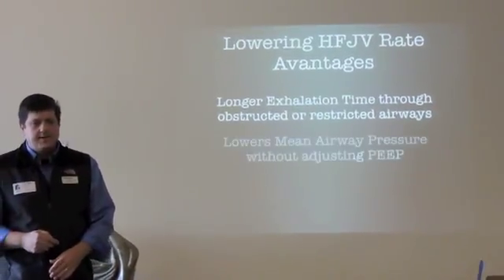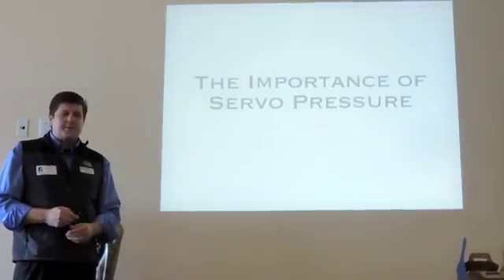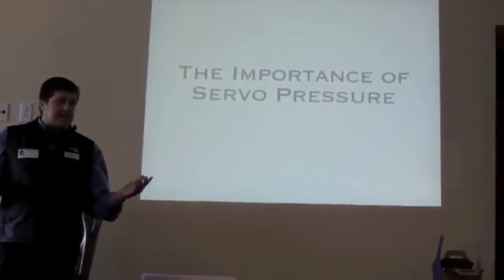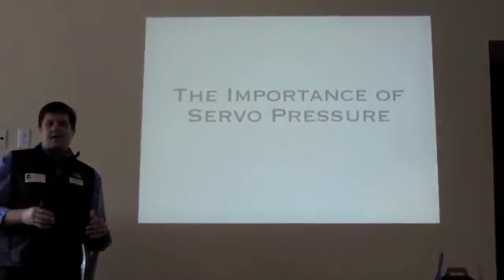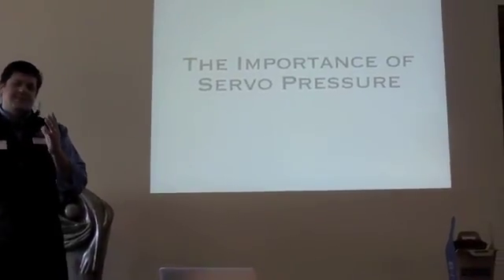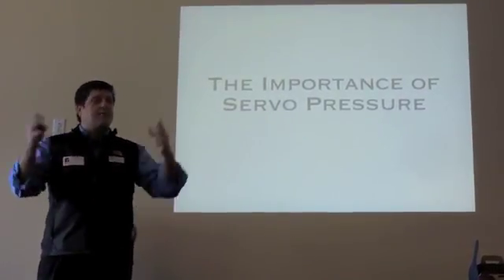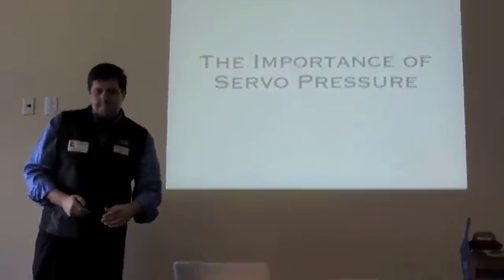So please take it. It's a very, very cool thing to use. Over the years, 420 works. It always seems to work, and that's, I think, for a long time why we never changed it. We had a kid with an air leak and 5 days later he might look better at 420. Now if we're dropping the jet rate to 300, I might get a better looking x-ray tomorrow, or 48 hours later, not 5 days. So the end result is the kid always got better, but now we're just making more out of this machine.